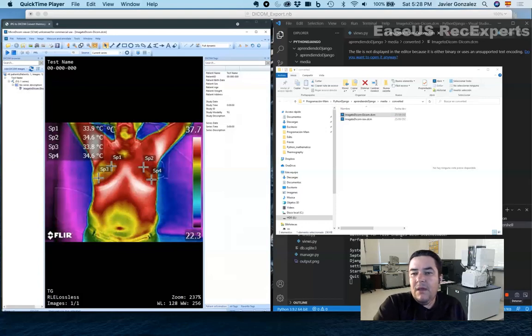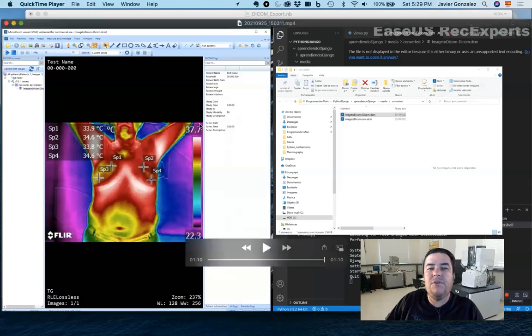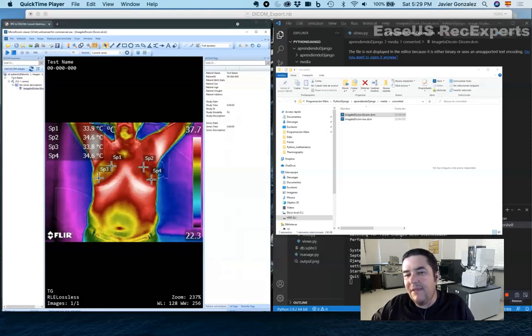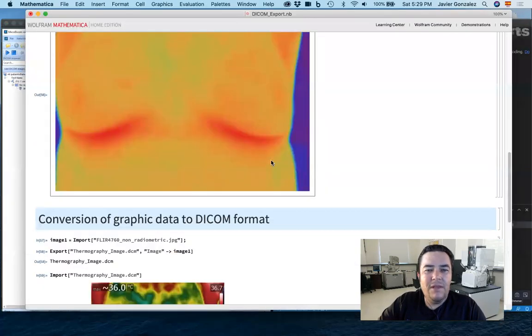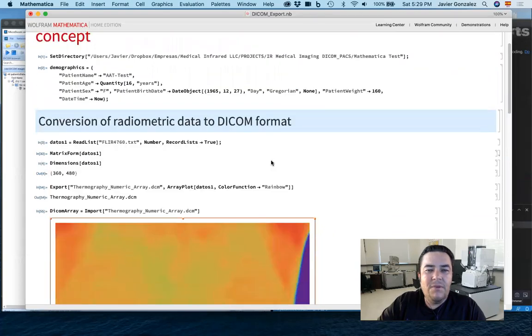I'm aware there might be other ways around this. Like I mentioned, you can plug in the minimum temperature and the highest temperature before generating the DICOM file, and then you can calibrate the whole JPEG file into a bunch of temperatures. However, for example, this logo is going to be super hot in the process. It doesn't seem like the best way to do it. If you just include the radiometric information, then you're going to see a clean image like this with just the temperature data.